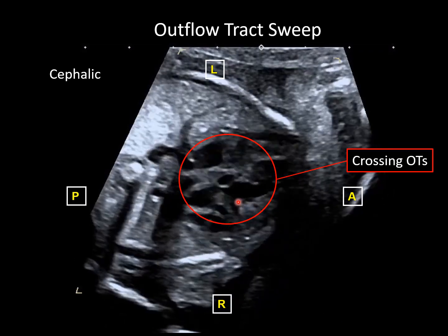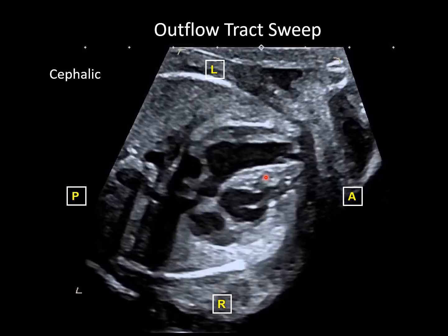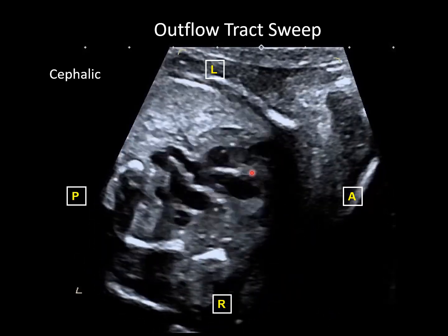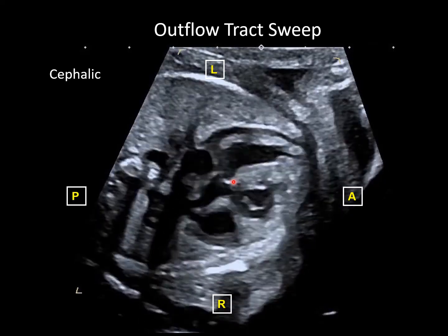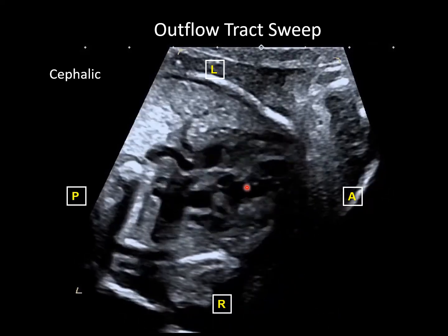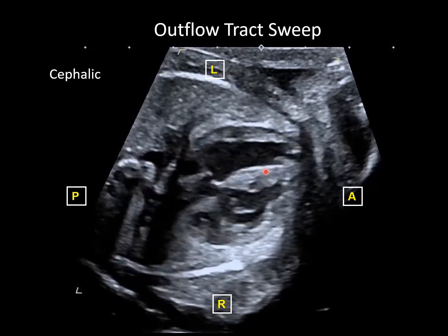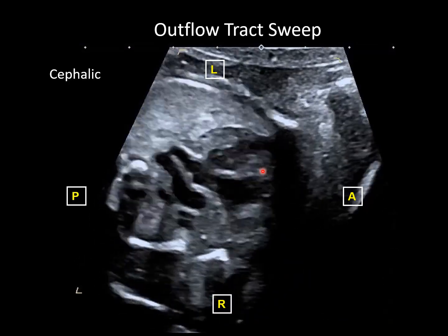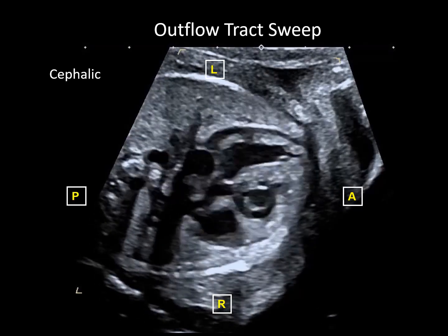This is a feature that you want to see once you sweep more cephalad in the fetus. At the same time, you're looking at the ventricular septum, making sure that it's intact all the way up to the outflow tracts with 2D, and this helps you to understand that there's no large defects with any semilunar valve override of the defects, which can be seen in defects such as tetralogy of Fallot and truncus arteriosus.